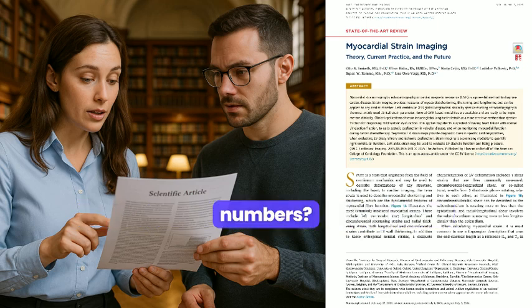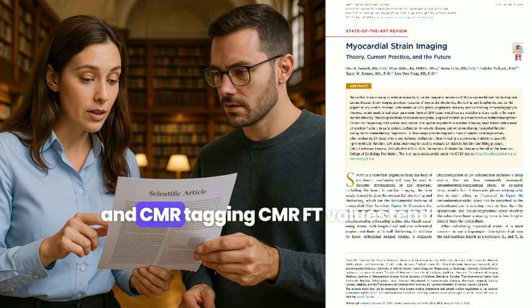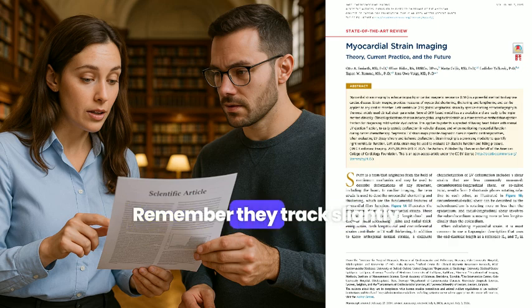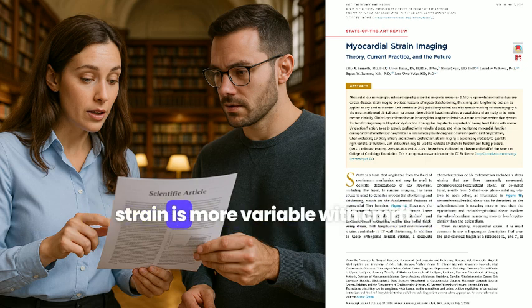Do they give the same numbers? Generally good agreement for global strains like GLS between STE and CMR tagging. CMR FT values tend to be a bit lower than STE. Remember, they track slightly different things, speckles within the wall versus contours. Segmental strain is more variable with CMR FT, not really for clinical use yet.